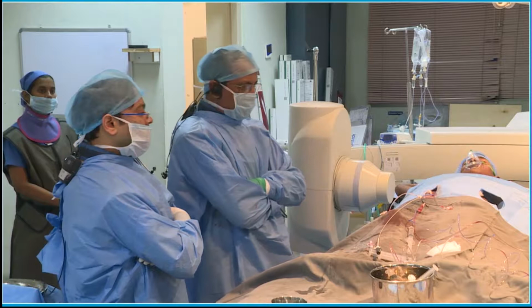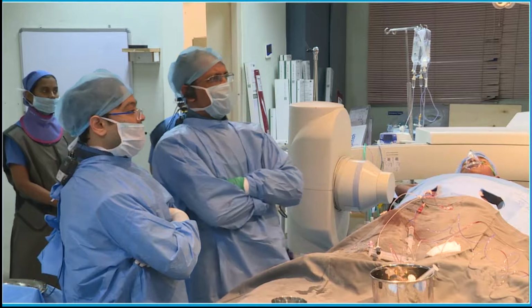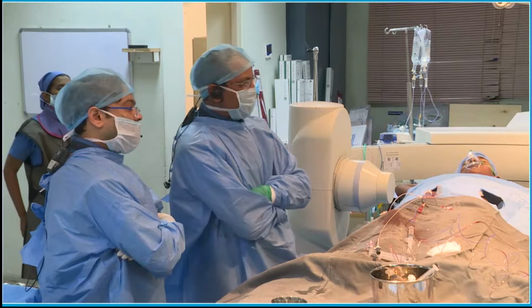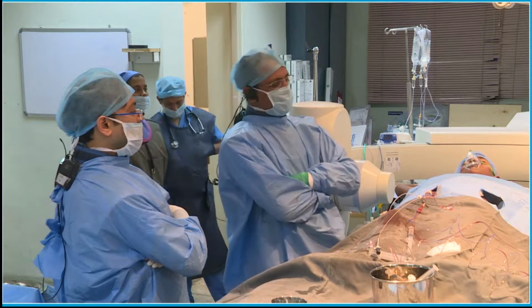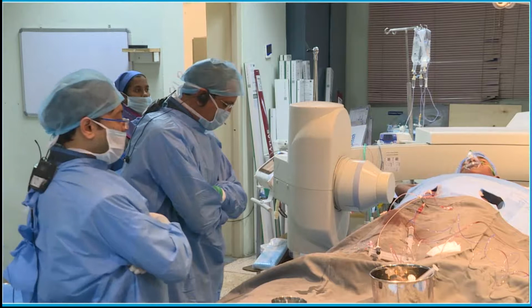What's your panel's decision on that? So everybody in the audience, whosoever uses this device, do they wait for 10 minutes to do an angiogram? Angiogram is not required. Angiogram is not required at all. So, yeah, agree. We can do an echo and finish it up. That's not an issue. But here, we are already in the cath lab. We did the angiogram. I think these are probably non-medical issues which dictate some of the decisions. So how many of you agree with me that we wait for 10 minutes to do the angio?